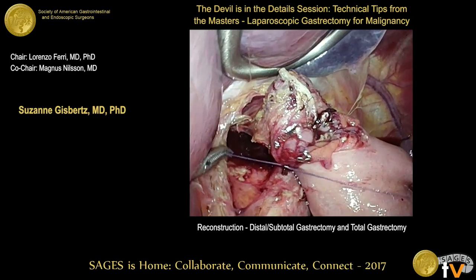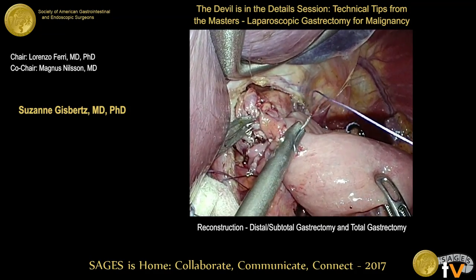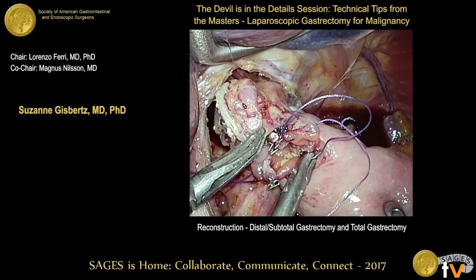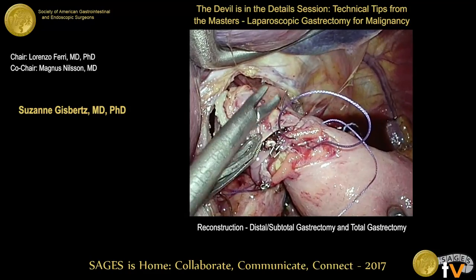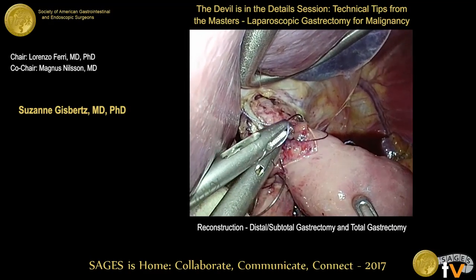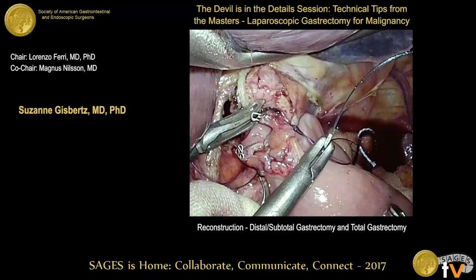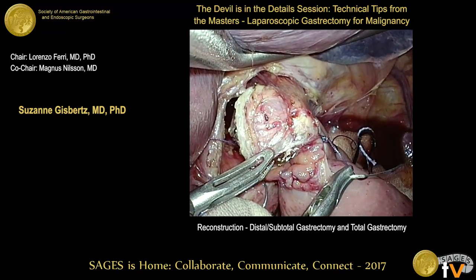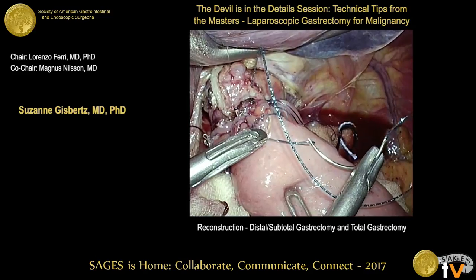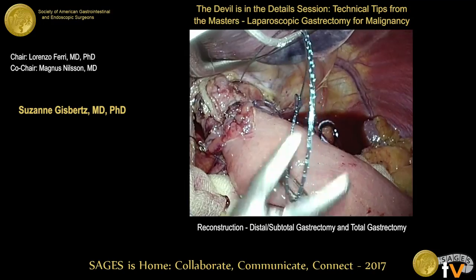He notes that Suzanne will present the functional end-to-end style next. It's probably easier to close the common hole using a linear stapler, but with this style one must be careful about stenosis when using a linear stapler — technically more difficult. That's why he uses V-lock and hand suturing to close the common hole.